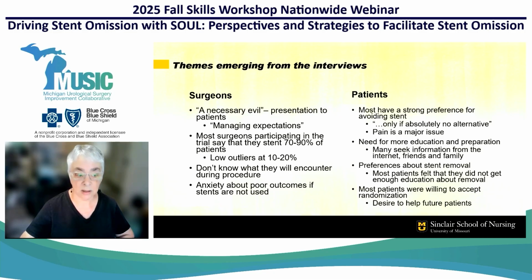We have interviewed a couple of surgeons who are low outliers, who say that they only stent about 10 to 20%. The issue that surgeons have reflected on repeatedly in their interviews with us is that they don't know what they'll encounter during the procedure, and that they have, in general, significant anxiety about potential poor outcomes if they don't use a stent.